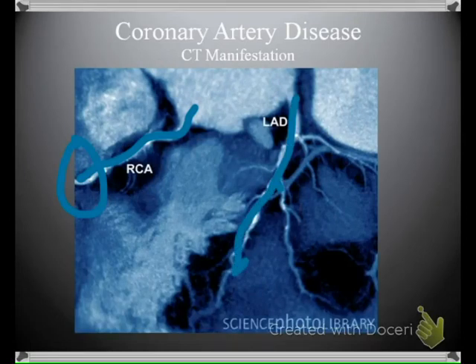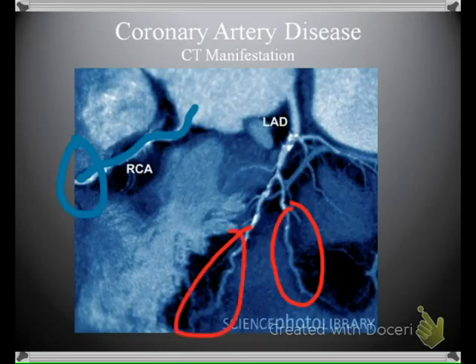And so the only thing that we could possibly argue is a potential stenosis is in this area and this area here, because we don't see that they have actually highlighted as well as the other coronary arteries.